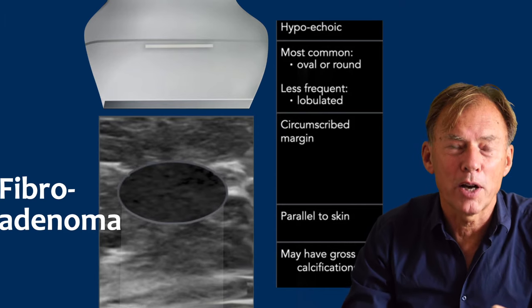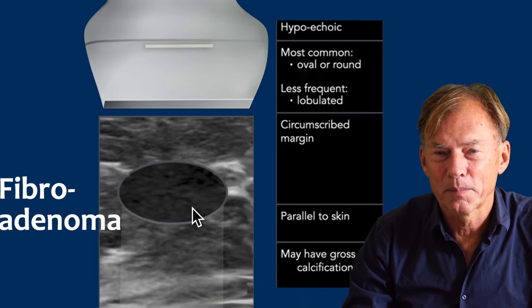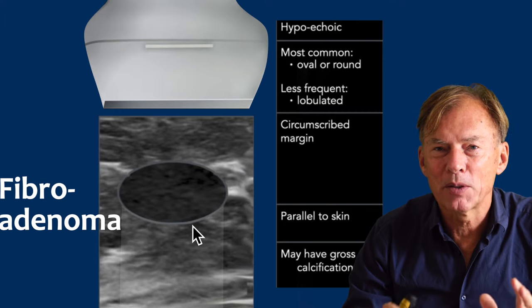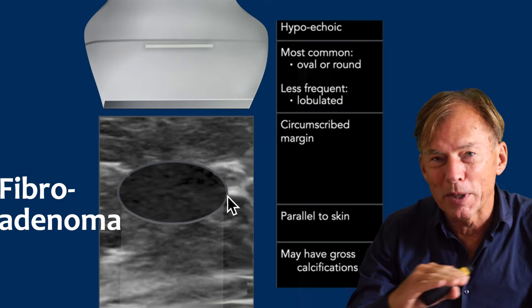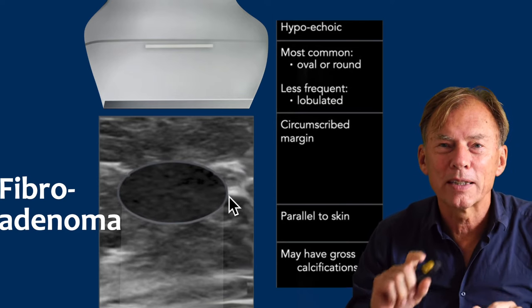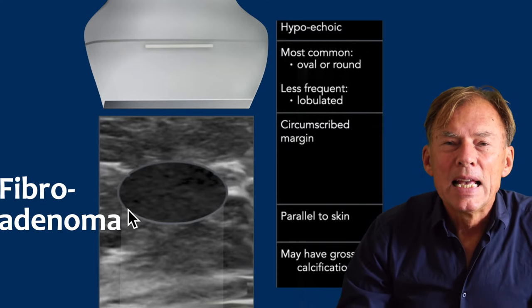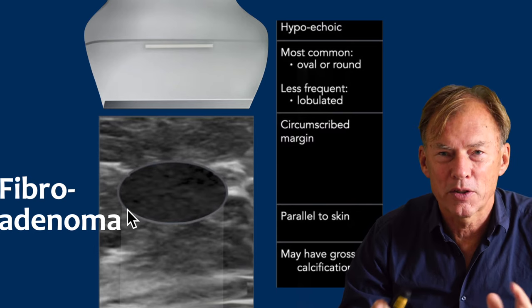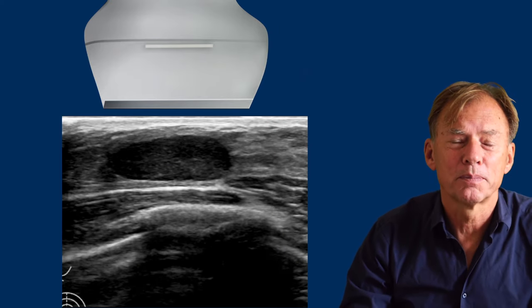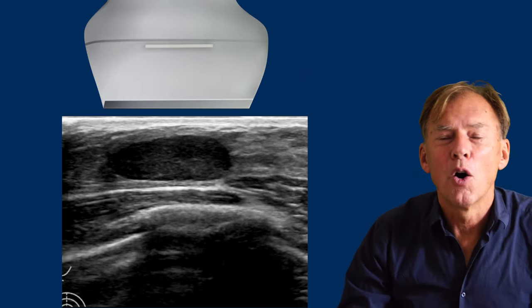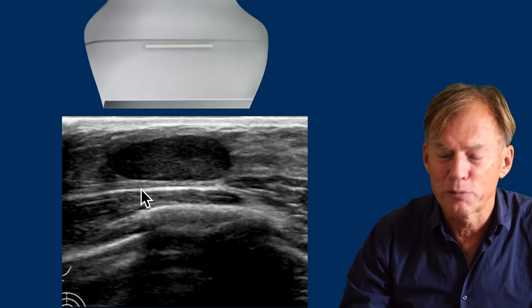Next is a fibroadenoma. The typical ultrasound features are a hypoechoic pattern, oval shape — sometimes round with two or three lobulations. The orientation is also parallel to the skin, so it's wider than tall. It has a sharp border, also called circumscribed margin. Blood flow within small vessels can sometimes be detected on color Doppler. Sometimes there's a little bit of posterior enhancement. Here is a typical fibroadenoma: oval shape, horizontal orientation, sharp border, and maybe a little bit of posterior enhancement.